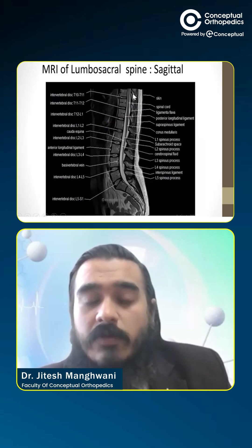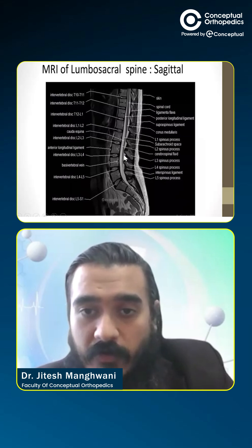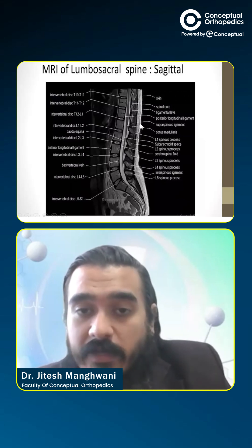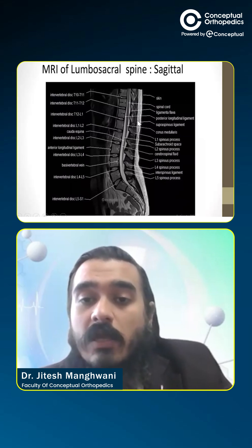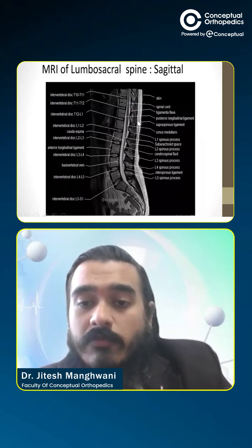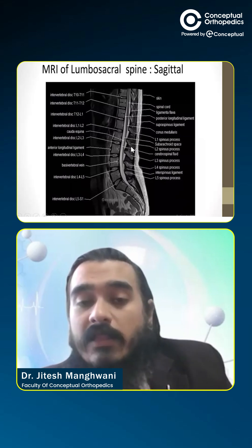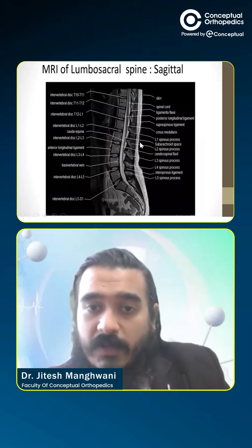This is the ligamentum flavum. The posterior longitudinal ligament is at the posterior aspect of the vertebral bodies. This is the supra-spinous ligament, which is present above the spinous process, and in between the spinous processes is the inter-spinous ligament.